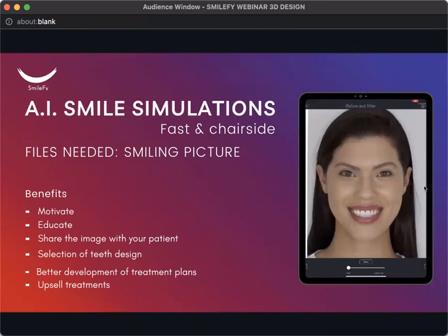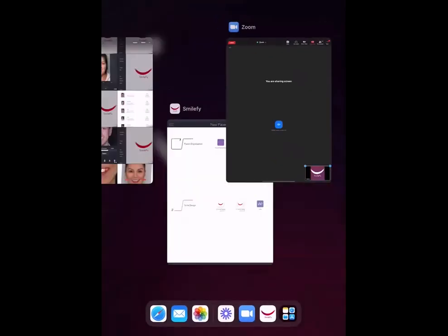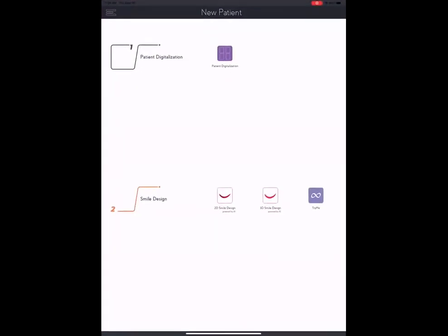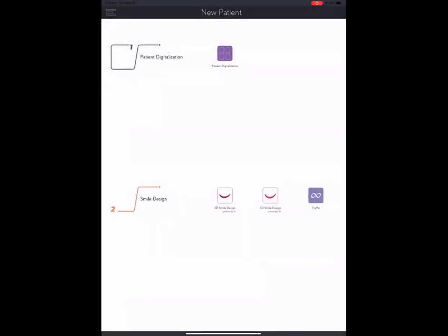So here, I'm going to share my screen to show you that it is possible for every practice, no matter how digital you are, or no matter how tech savvy you are. You and your dental staff, as I can see that we have also a couple here today, can deliver smile designs in your practice.